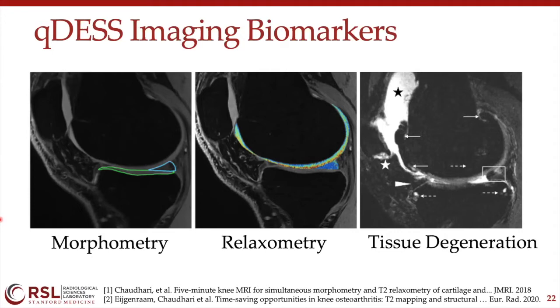So you are telling me it's digital and pixel-based, how thick or how wide or how deep, based on that you do your measurement. Can you have any artifact? Basically I'm asking how much false positive or false negative there is, because it's a digital one. Is there anything, do you feel the accuracy is pretty good, like greater than 90% or 95% or something?